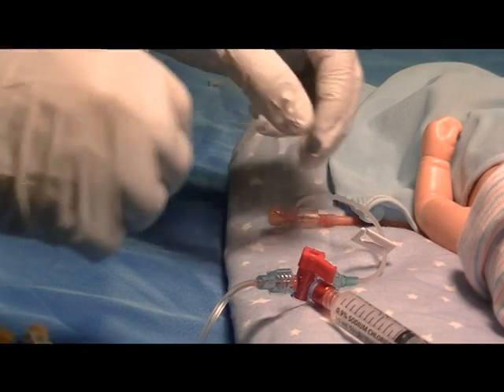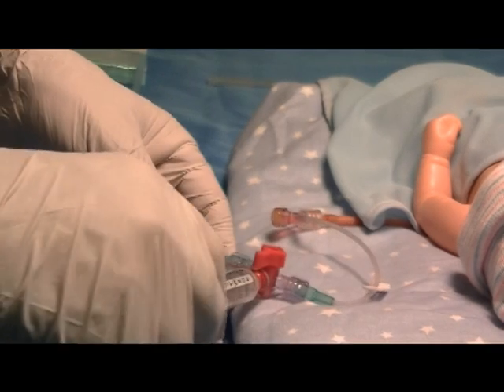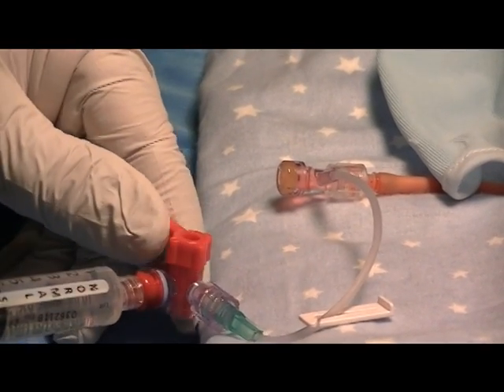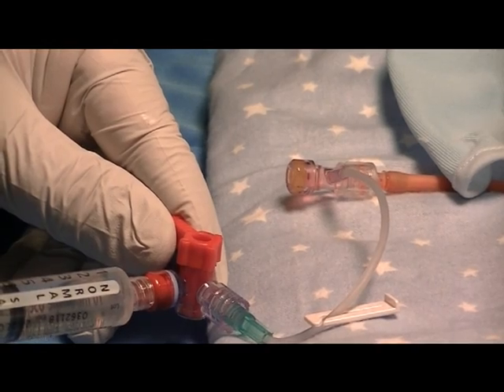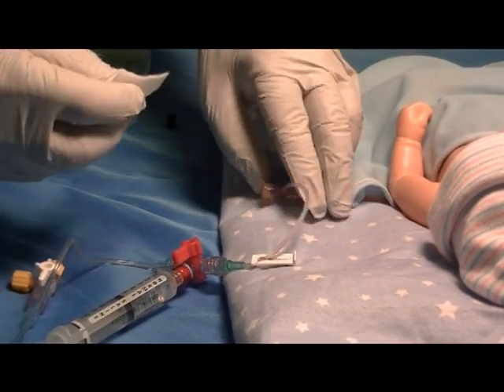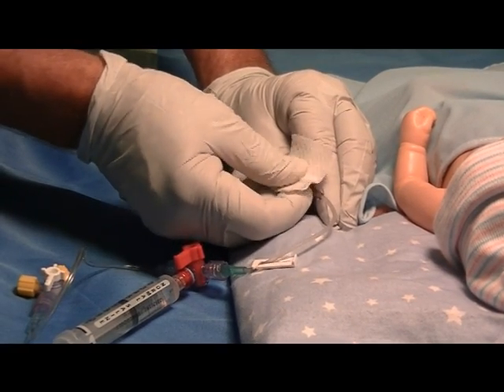Next, go to the line, unclamp the T connector to flush the line, and give approximately 0.5 ml of flush to flush the catheter of blood. Then go back to the T connector and swab it to remove any residual that might be present.